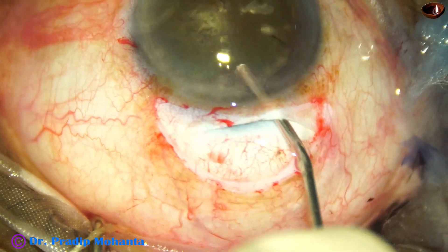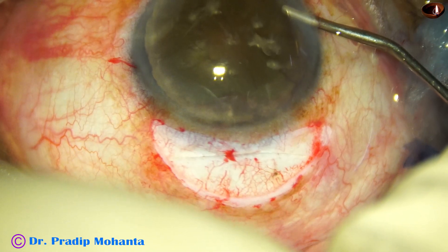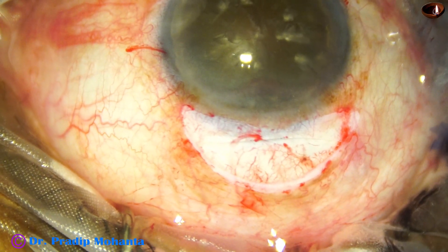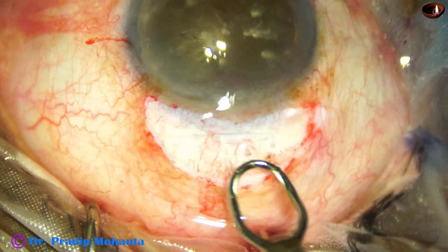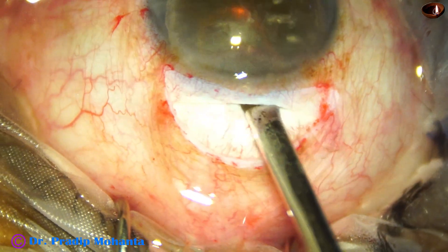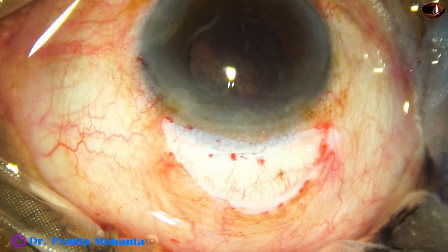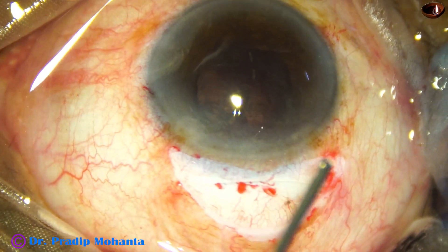Now we have to protect the corneal endothelium nicely. Viscoelastic is injected both in front of and behind the nuclear mass. In this case, I am going to use an irrigating vectus. See how beautifully — this is the trick — very easily we can deliver the nucleus, provided the wound is adequate.